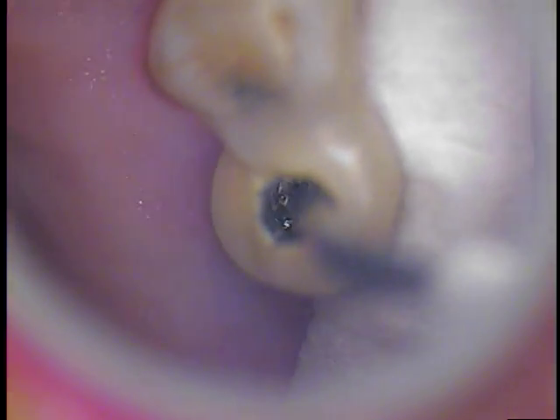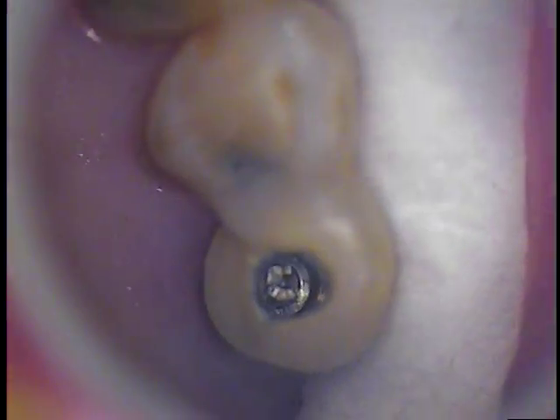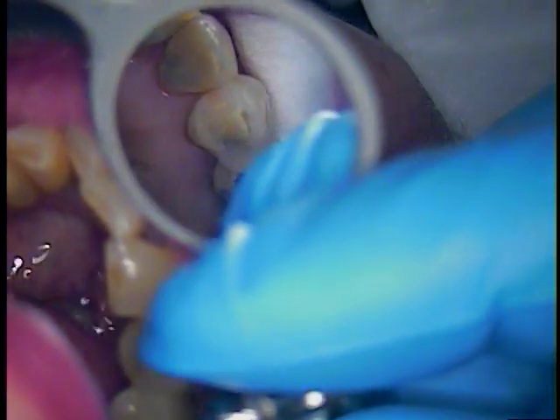A little better vacuum. I think it's time to get the screw out. We're going to go in there again. I'll lower the magnification, and we're going to go in and kind of make sure this bottoms out before you start turning.